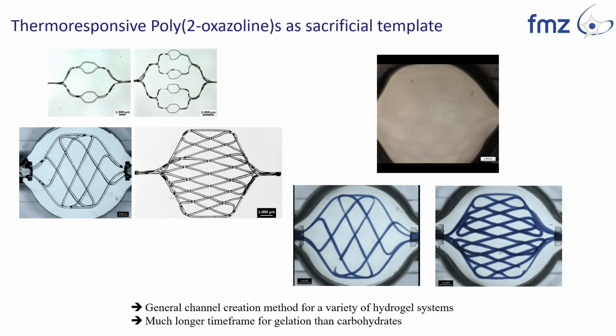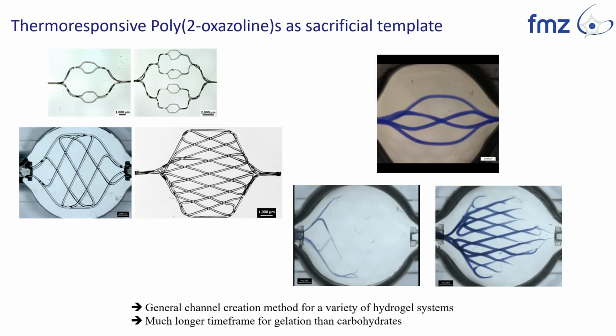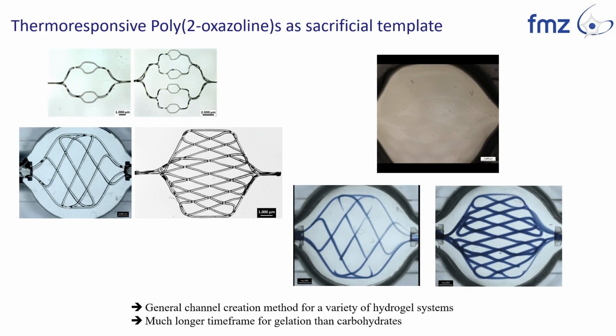So, for example, it works with methacrylated gelatin, methacrylated collagen, fibrin. However, it does not work with collagen 1 or Matrigel, for example. And also, compared to carbohydrates, to sugars, we have a much longer time frame for the gelation of the gel.